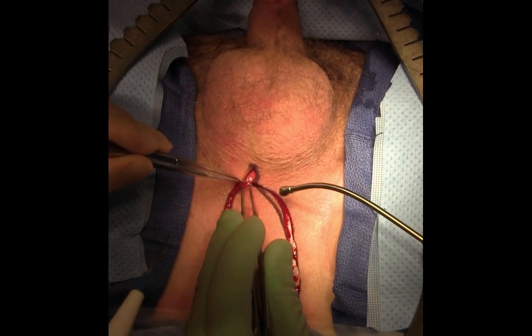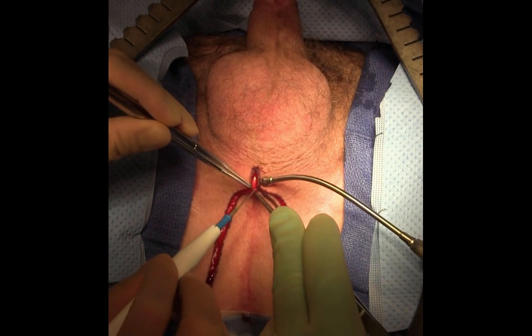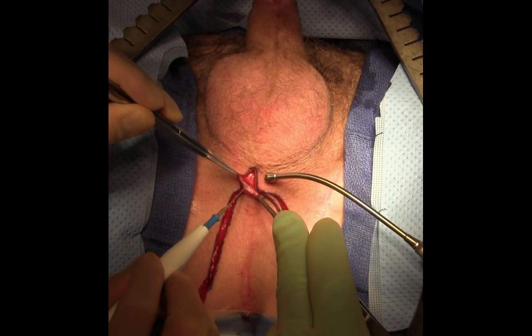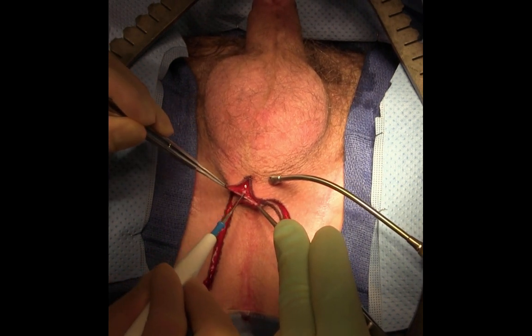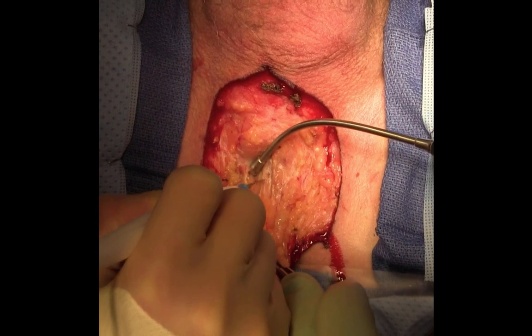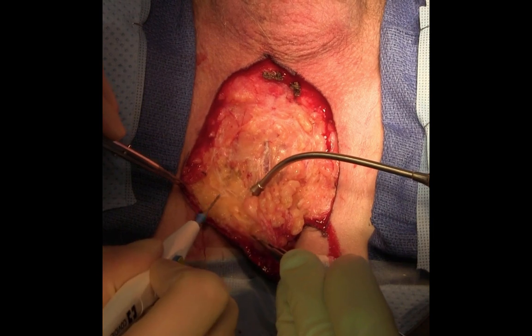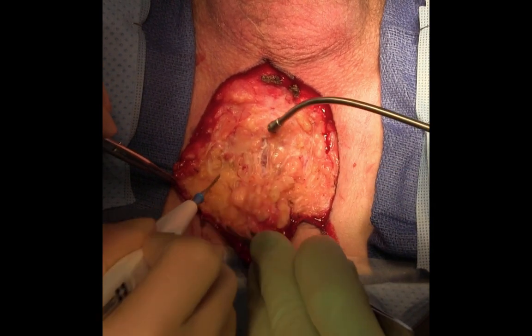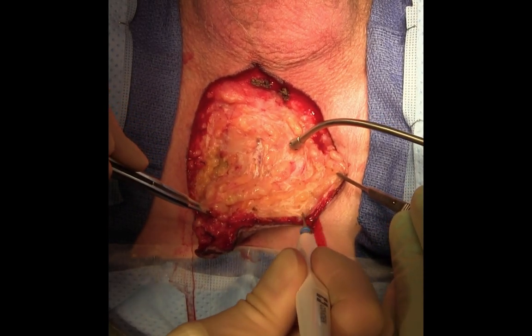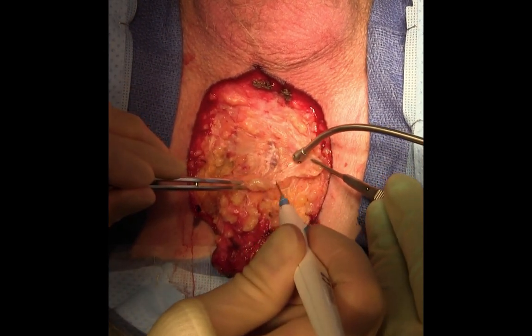The incision is made with Bovie cautery through Colles fascia. It's very important that the inverted U advancement flap is made full thickness to spare blood supply to the tip or apex of the flap. Here you can see creation of the advancement flap. It's created as a full thickness flap, pulling the entirety of the flap off of the overlying fascia of the bulbospongiosus muscle. It's critical to keep the flap long enough and to make the apex at the base of the scrotum. The external sphincter and apex of the prostate can be surprisingly deep.